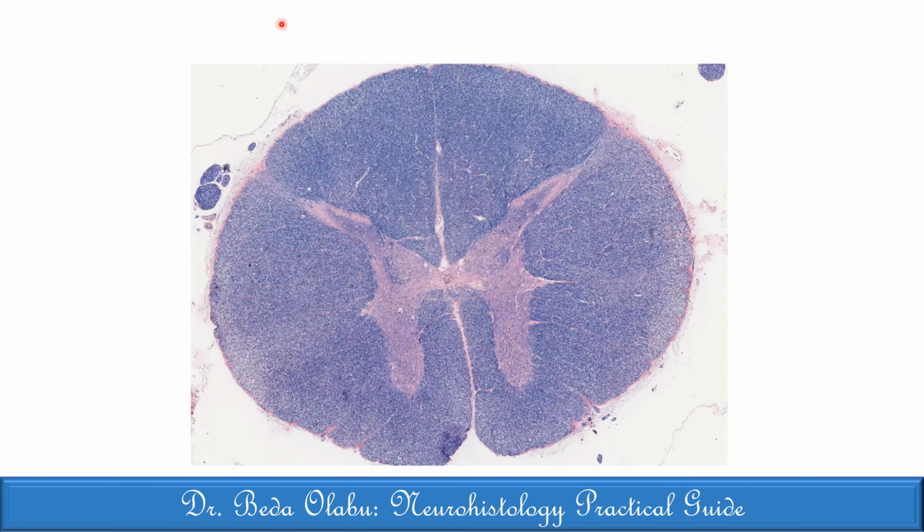Then both the anterior and posterior gray horns are very thin. And we can actually see also that we have a lateral horn. So most likely this one with the lateral horn, I'll take it to be the thoracolumbar region, T1, L3 there, because of that lateral horn and also the thin, both anterior and posterior, with plenty of white matter tracts.